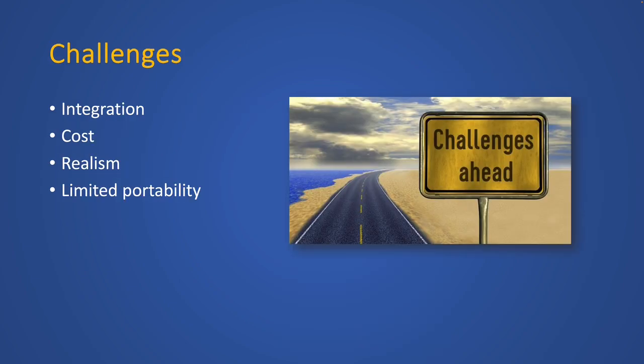But any technology is not without its challenges. The first challenge involved with this technology is integration. Careful consideration as to how medical procedure simulators are integrated into existing curriculum must occur. Planning will ensure learning outcomes are optimal and consistent.